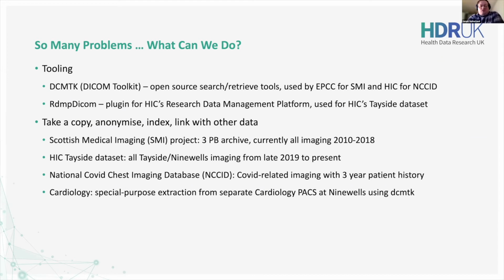There's a smaller data set within HIC, which covers the imaging in the Ninewells Dundee PACS. So it's only local data, but we have all of that from late 2019 up to roughly the present day. So that can be useful in itself for more recent imaging.